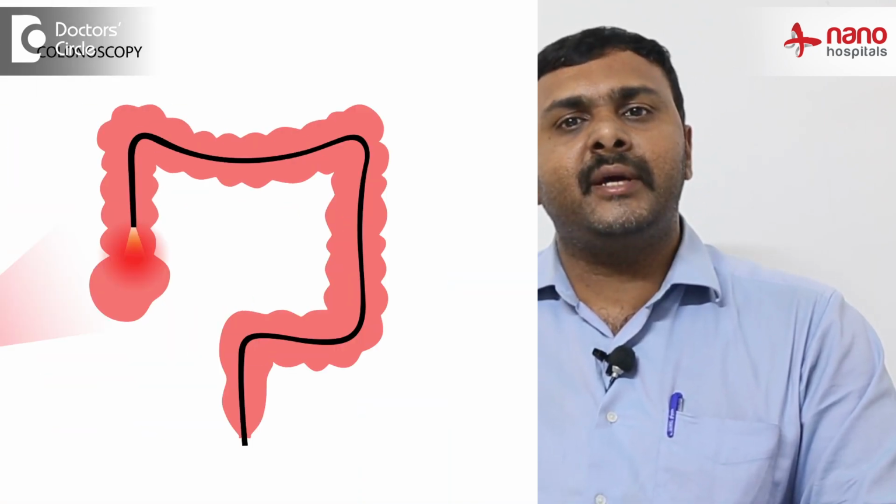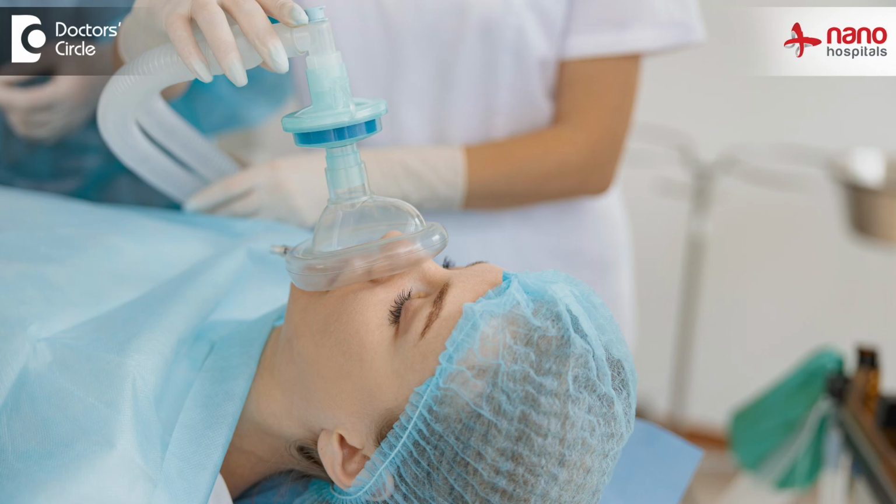Coming to the colonoscopy, the camera is introduced through the anal canal and as the camera advances the intestine is filled up with air. Due to this the patient will experience some amount of bloating sensation of the abdominal cavity and during the passage of the scope through the intestine, at a couple of places there could be some pain. So generally the colonoscopy is done under sedation so that the discomfort is minimized.